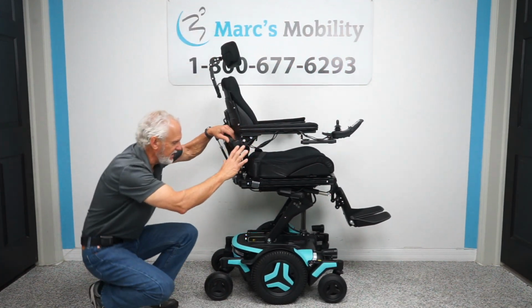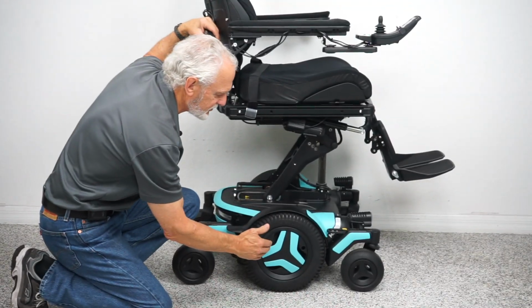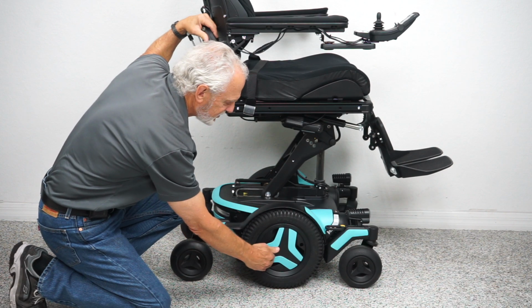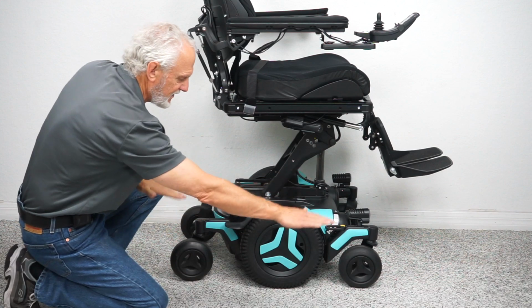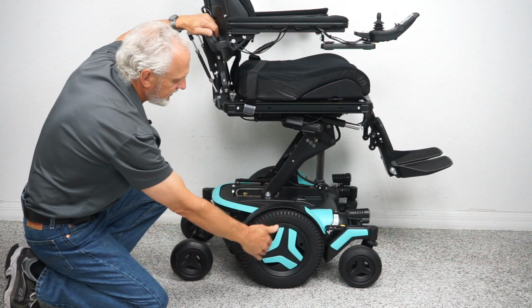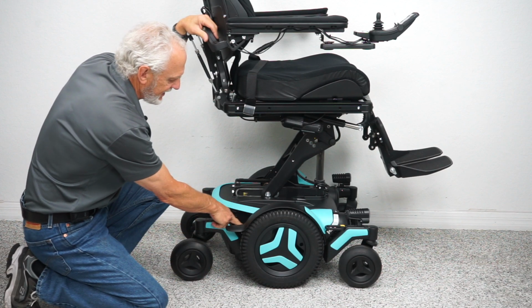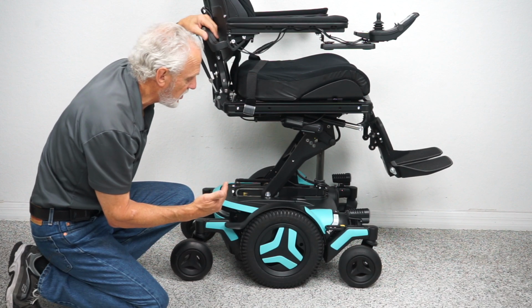So while we have the seat up, let's look at the base since it's elevated. This is a mid-wheel drive chair, so that means the drive wheels are in the middle. When you have a mid-wheel drive chair, you always got to have a wheel on the ground in front and a wheel on the ground in the back to keep it stabilized, because all the center of gravity is in the middle, okay? So there's a suspension back in here you can't see in the video, but these are Permobils. They have some of the best suspension on the market.